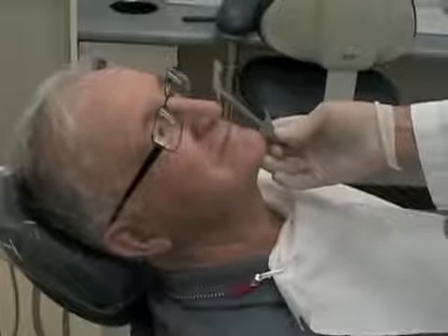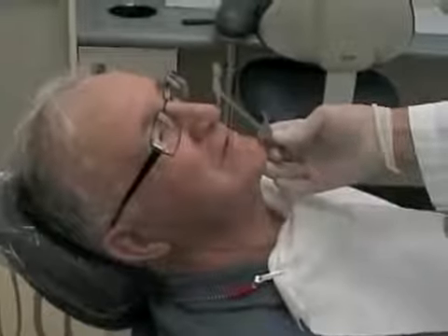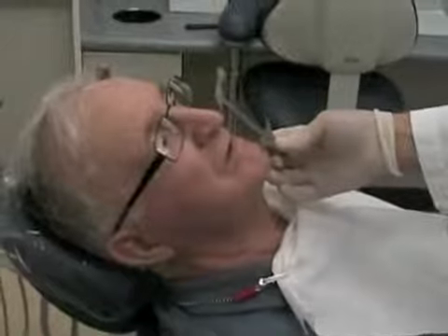For all measurements of occlusal vertical dimension, make sure the patient is not laying down like you see it here. The patient should be upright. Insert the maxillary record base and wax rim and check for lip support in profile and also for the length of the incisal edge.